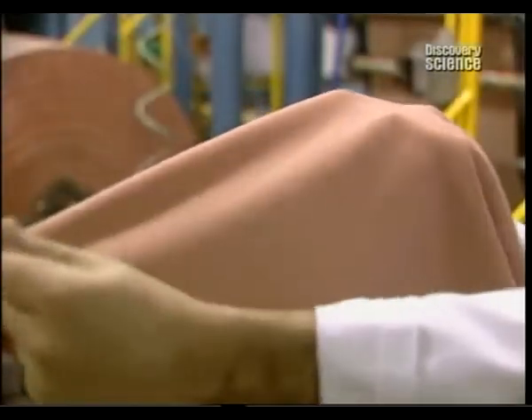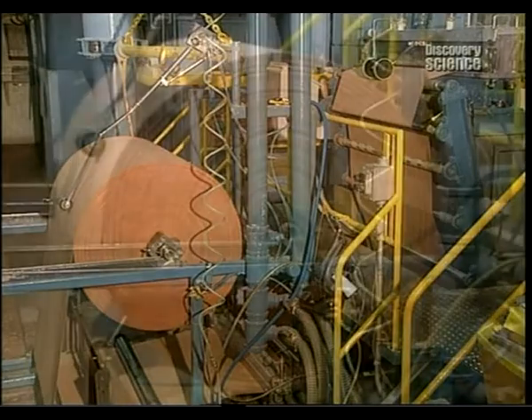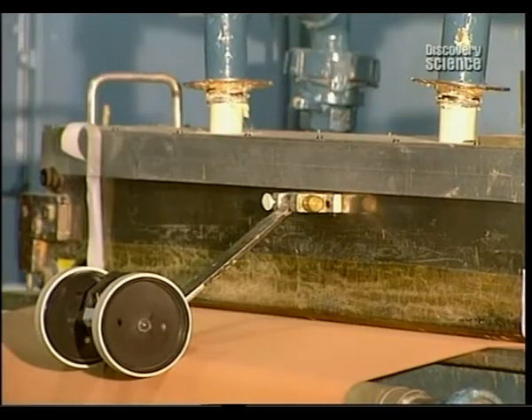Plasters are made of various materials, but the main one is called ETS, a fabric which is elastic in only one direction and forms the adhesive part of the bandage. This 1,800 metre roll of fabric can make 1,800,000 plasters.